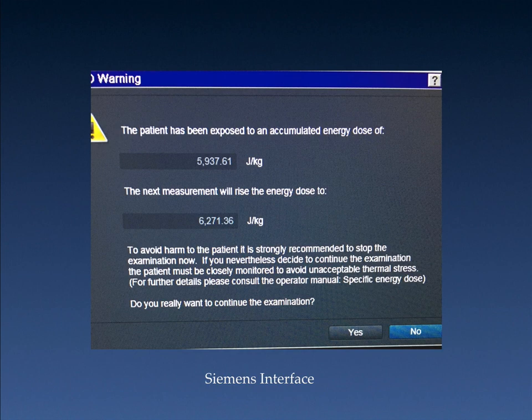Perhaps you just get a radiologist involved and take a look at the patient's condition, what you're doing, what you have left to do, and decide how to handle it. But I do think if you're getting a message like this, you need to have some policies and procedures that clearly define for every operator what to do in this circumstance.